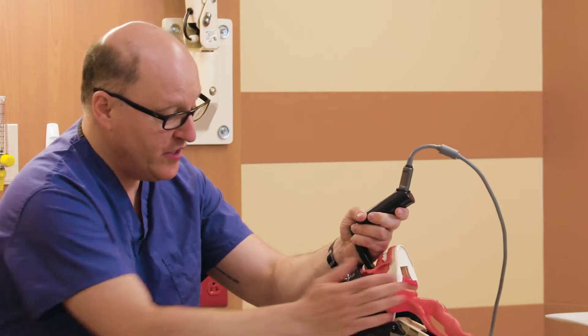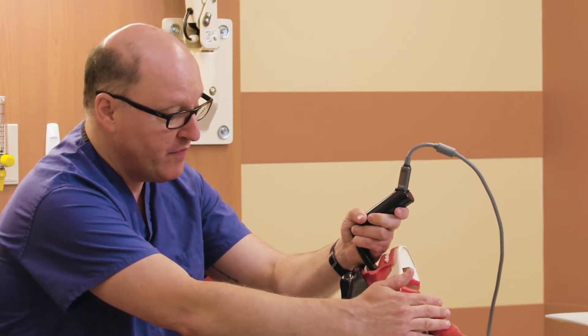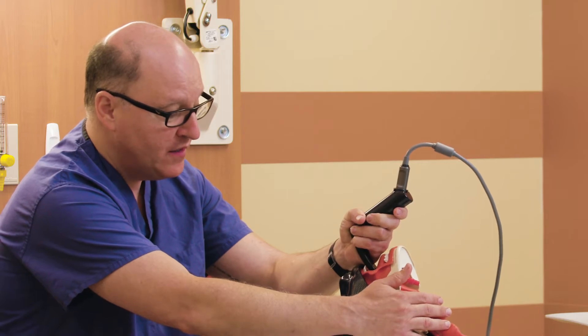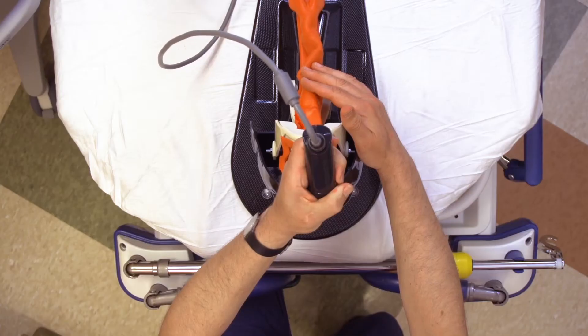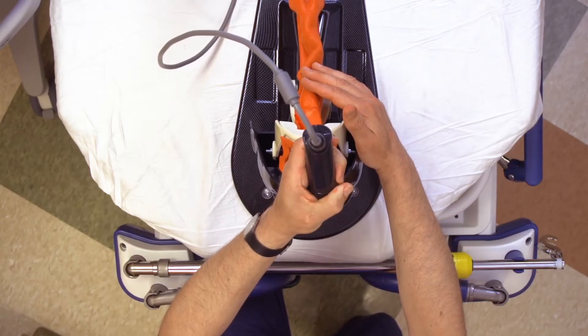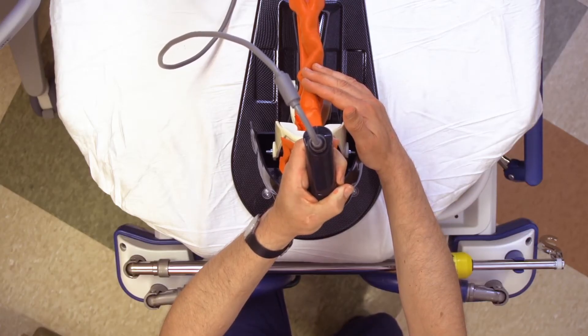I'm reaching around with my right hand and I'm improving my view. At this point, I am actually sighting the target with my right eye only.